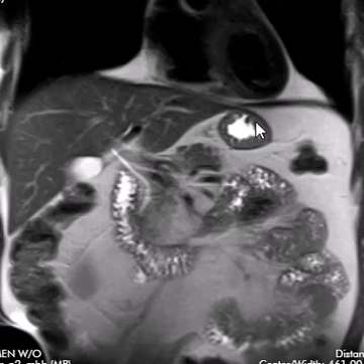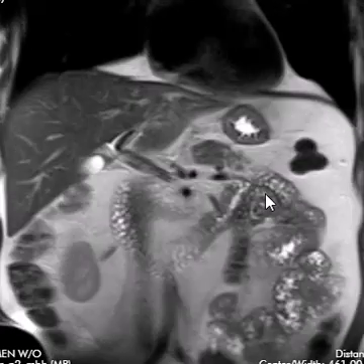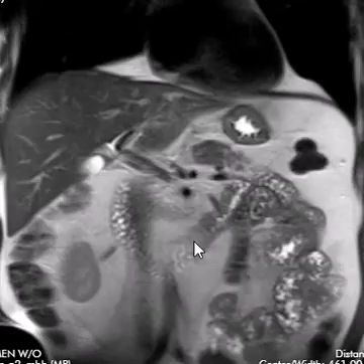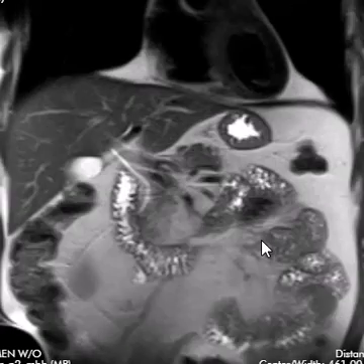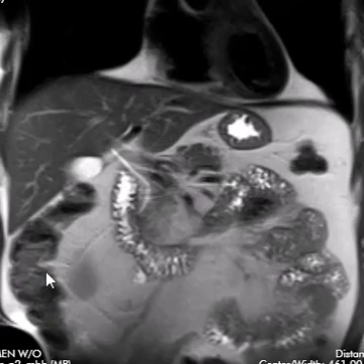And this bile comes down and leaks out into here, helping to digest the food. This is the stomach over here, and over here you can see all these intestines — these are the small intestines. The large intestine is over here.